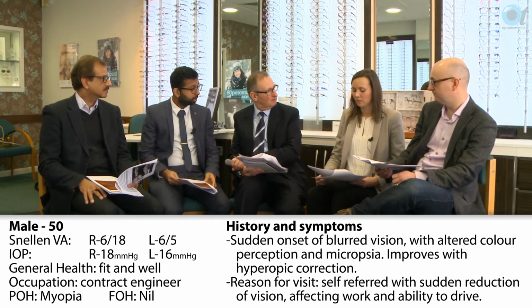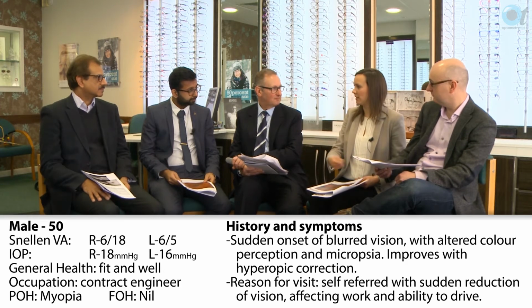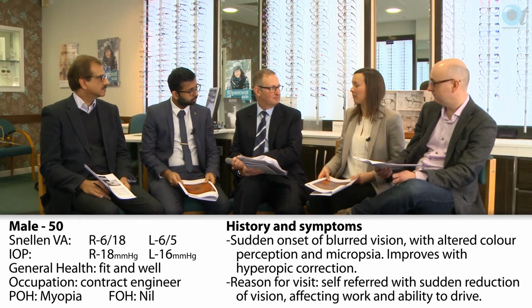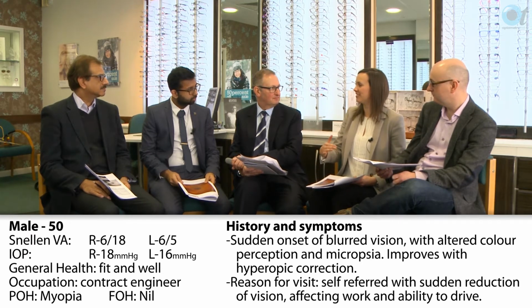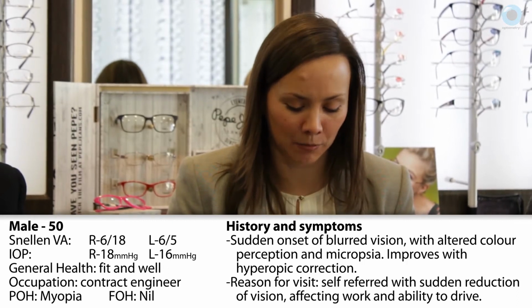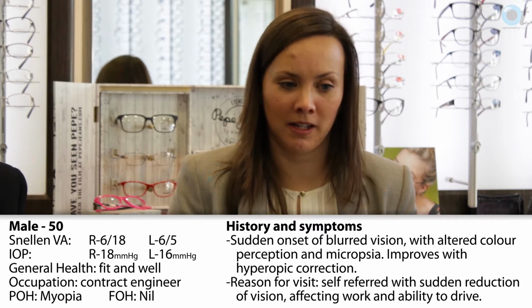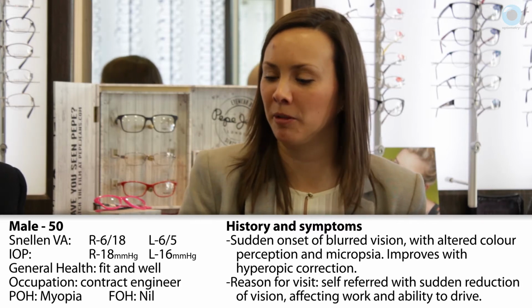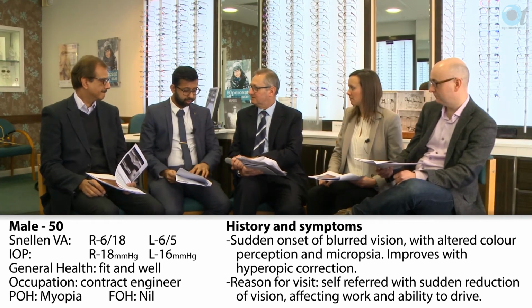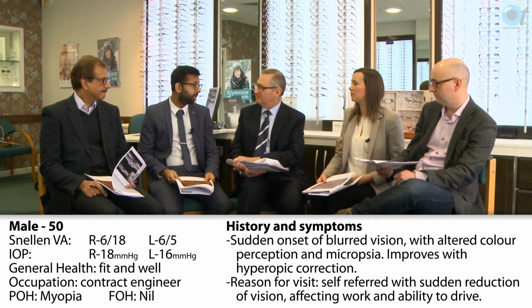Right. What was your view? In my area, we've got two choices. We've got the fast track, fax them to wet AMD service, or we have direct referral to hospital. And actually, unless it's pick up the phone and send them straight in, there isn't any in between. And I think I'm not seeing any hemorrhaging. I think I would probably send it via my direct referral, but not in the fast track wet AMD faxed service. Saying that, if I didn't have the OCT image, I'd send it via a wet AMD referral, because I wouldn't be too sure. It would be more difficult to make a diagnosis, wouldn't it?